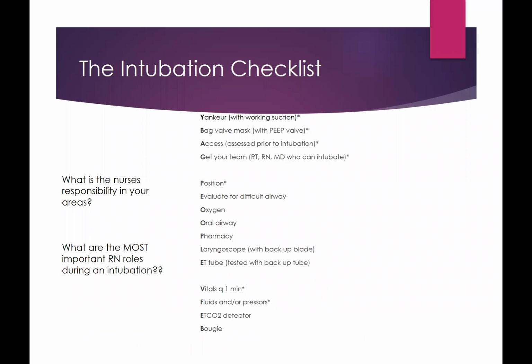So the next thing I want to look at, and this is just a very brief overview, is an intubation checklist. This is something that is really expected. In the department I'm in, our fellows predominantly intubate, and the expectation is that the fellow and the respiratory therapist at the bedside run through this checklist as things are being intubated. And there are a couple things that I want to pull out for responsibilities from the RN standpoint.